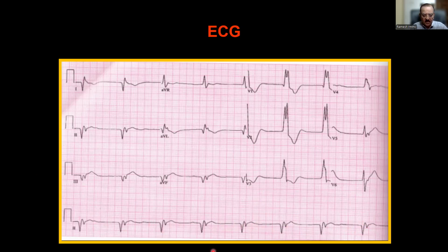So you don't see any P wave. That's what you have to understand. That means it has not fired an impulse. Everybody clear about the P wave? Normal values? Yes, sir. Right atrial enlargement? Yes, sir. Left atrial enlargement? No P wave. Right? Only 3 abnormalities can be there in the P wave. Nothing else.